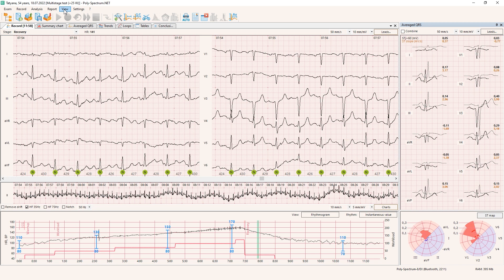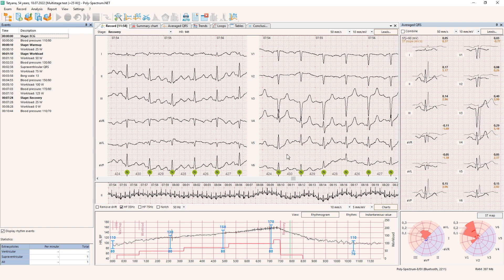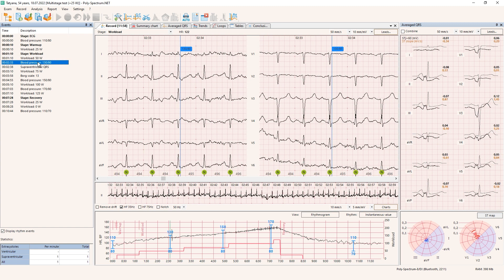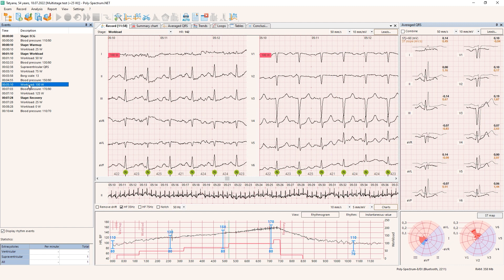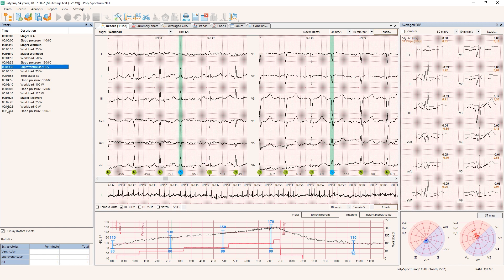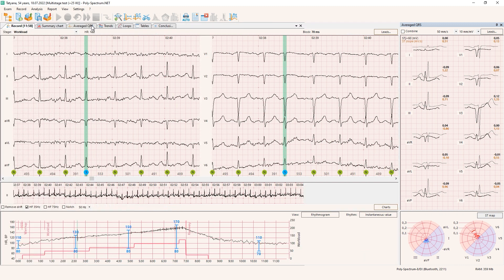One thing I also want to show is the events window. Everything that happens during the recording — blood pressure measurement, workload changes, events detected by the software — is listed as events. We can see this list and quickly get to any point. For example, the software shows me supraventricular QRS complexes — that's again the extrasystole we already reviewed. It's easy to jump to the event and review, print out, or perform other measurements or actions.